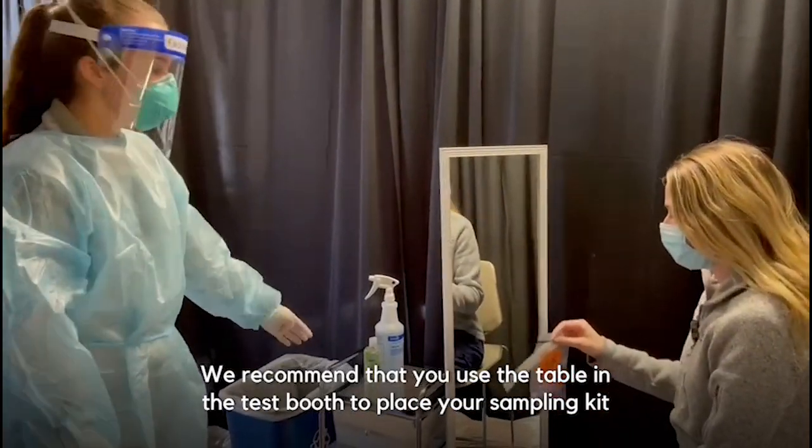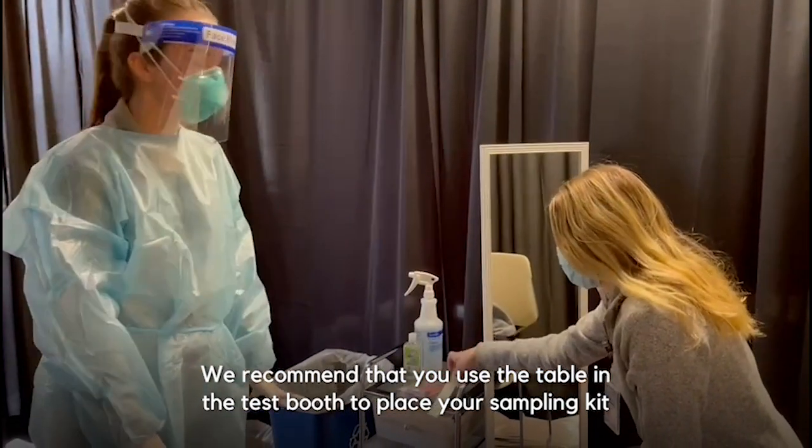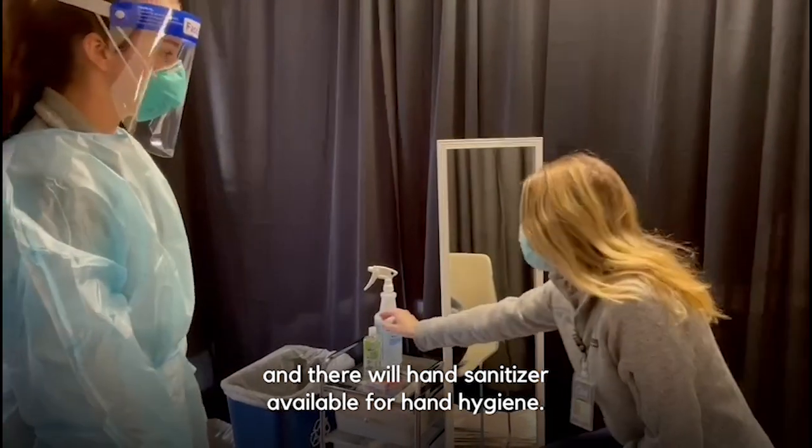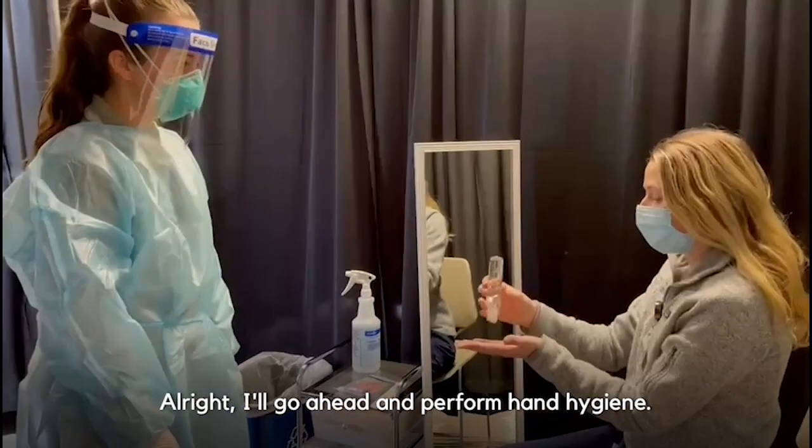We recommend that you use the table in the test booth to place your sampling kit. There will be hand sanitizer available for hand hygiene. I'll go ahead and perform hand hygiene.